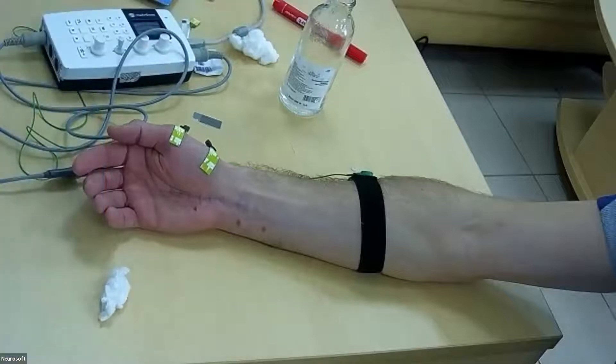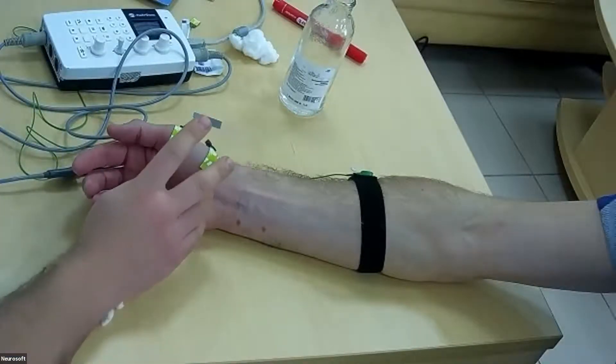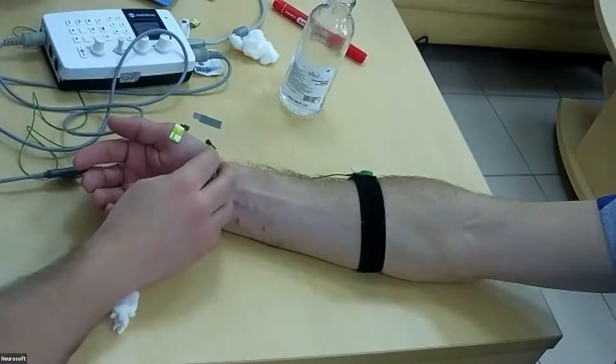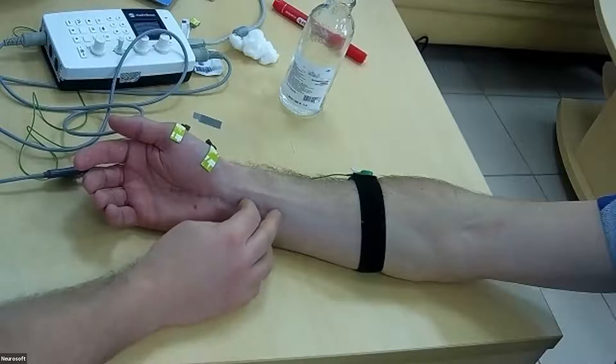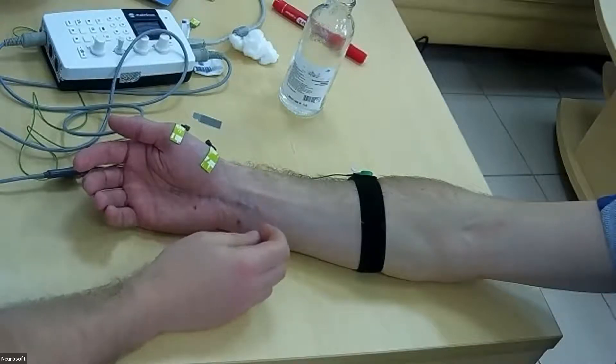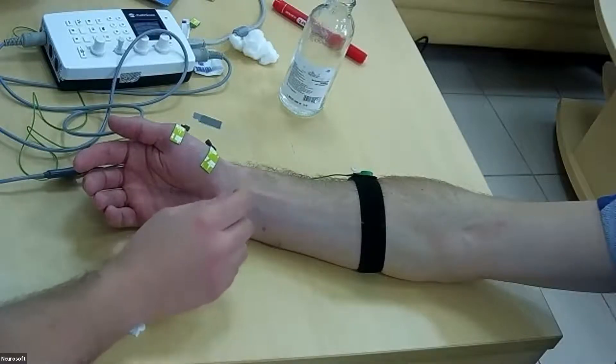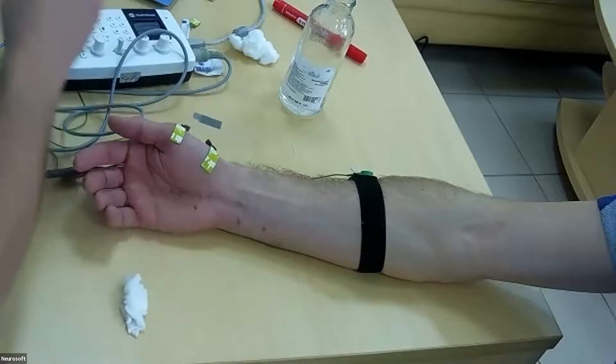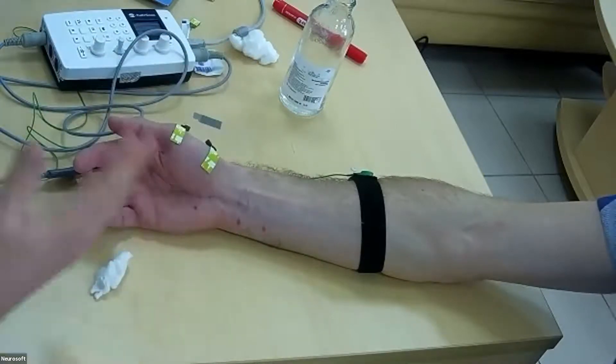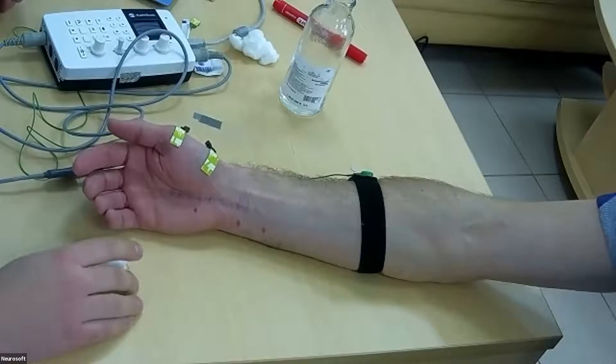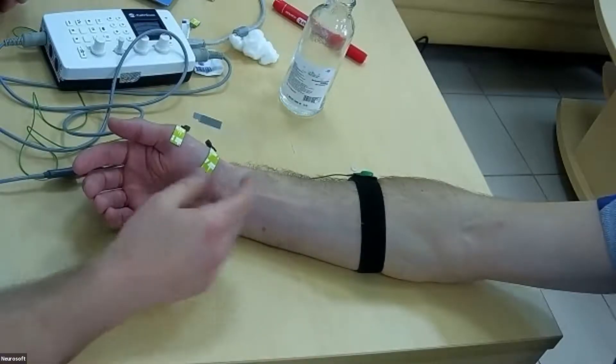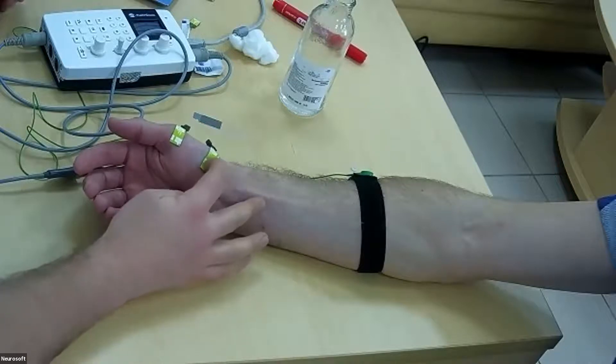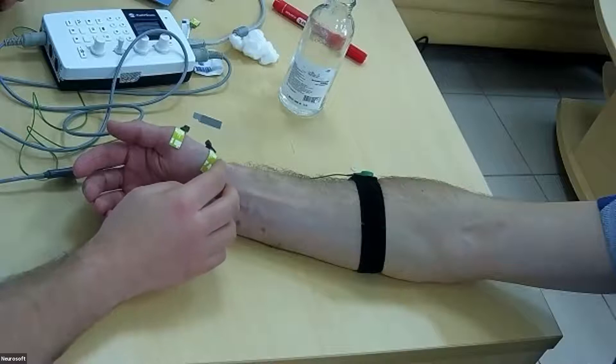We use Miri's method with classical muscle abductor pollicis brevis and the same stimulation. We need different types of tension as Michael said. For this method, we need to perform the motor conduction study with registration of compound muscle action potential.